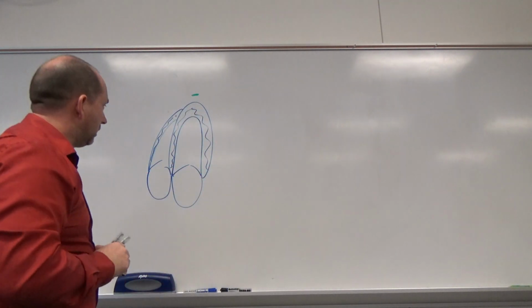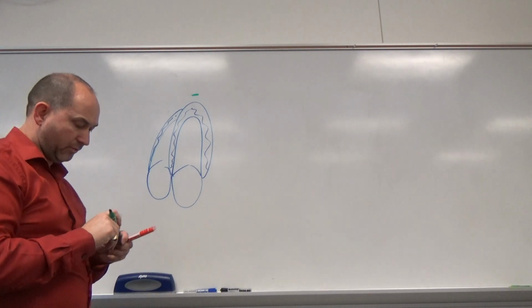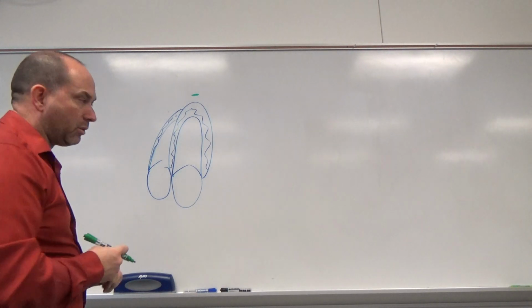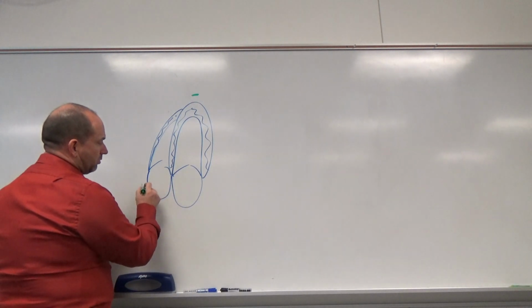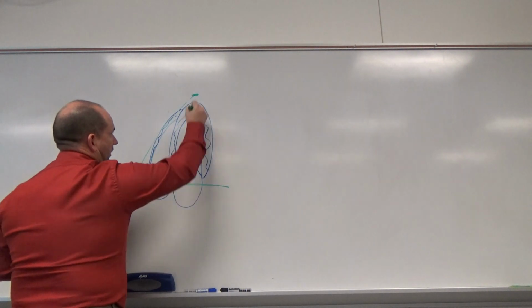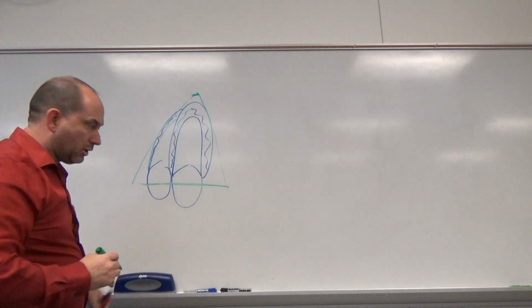Okay, in this view, we're not going to do that this quarter, but for the first quarter, but for 253, we are in 254, we are going to measure the Simpsons. So I'm going to show the Simpsons real quick. You're going to take your depth down to about here and get your sector size so that you have just the LV. You need to see the walls really well.